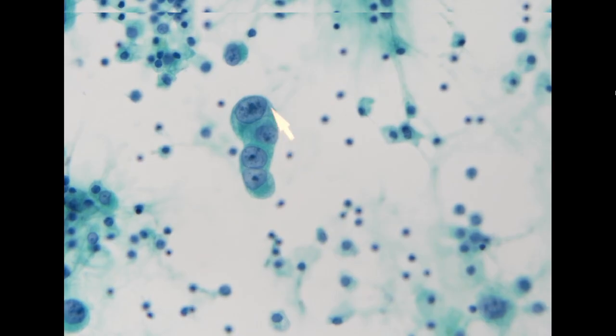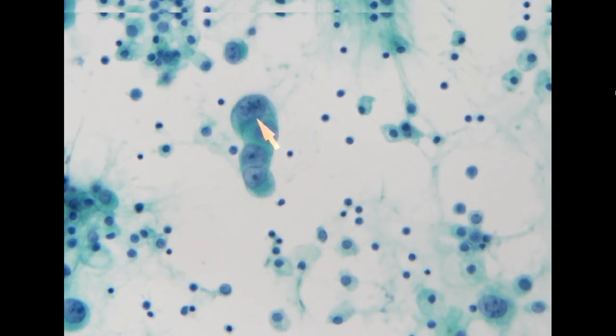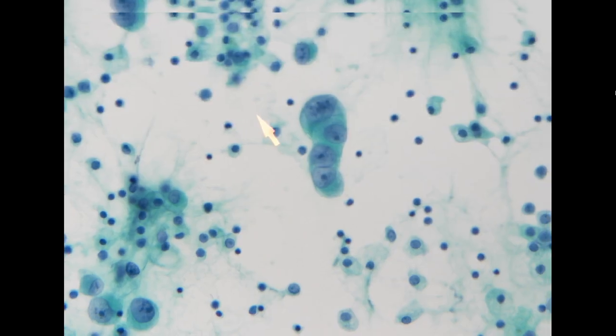Just based on the architecture pattern, it looks a little bit like mesothelial cells, because there seems to be an intercellular window. However, if you check the nucleus, the size of the nucleus is gigantic, and the size of the nucleoli is almost as big as the adjacent lymphocyte. So this is definitely not normal. So these are cancer cells.